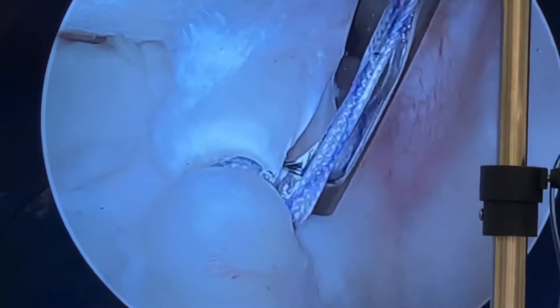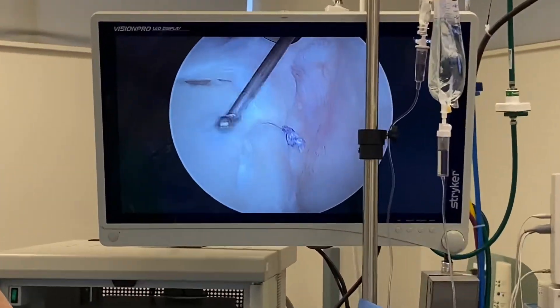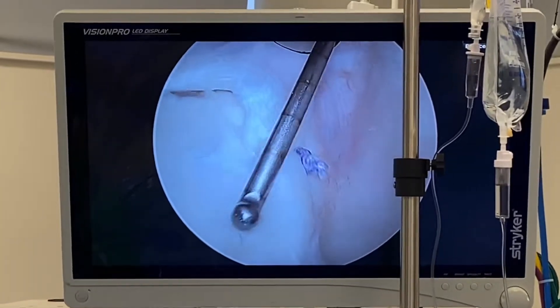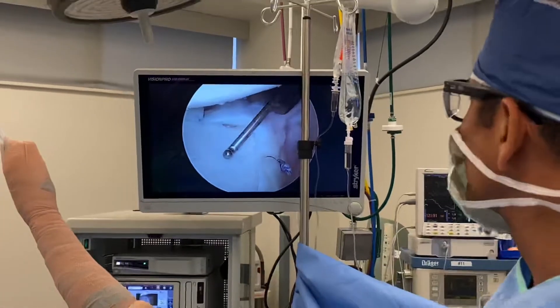That looks really nice. Superior labral repair — superior labrum attached nicely there, it looks really good. This patient had a prior biceps tenodesis in the past but continued with catching and locking.